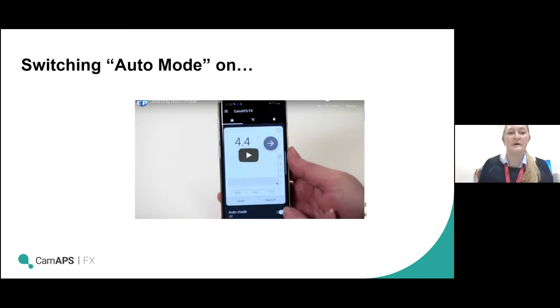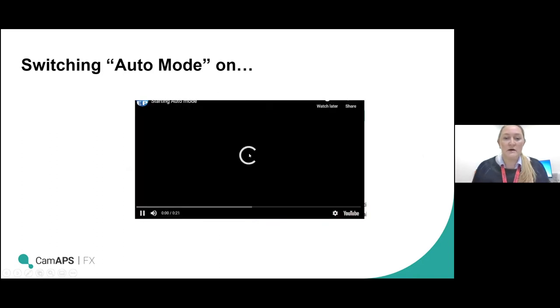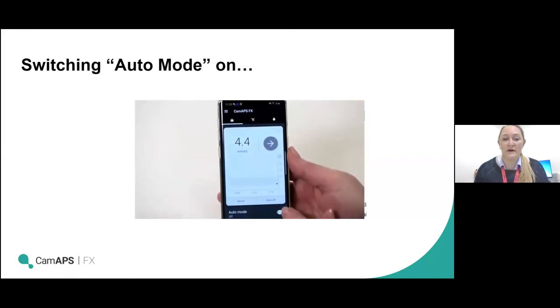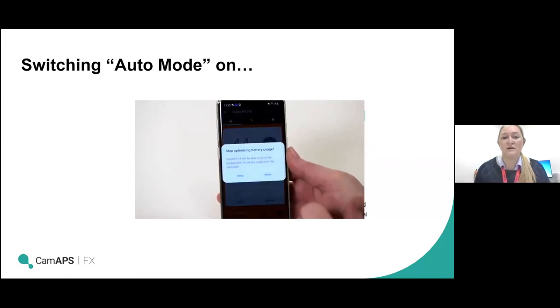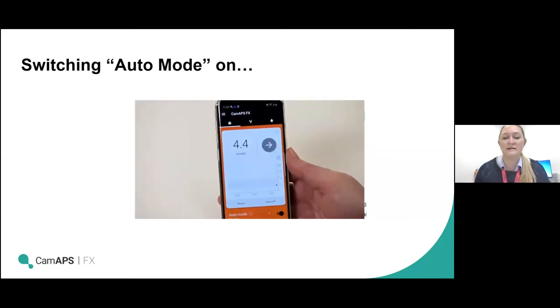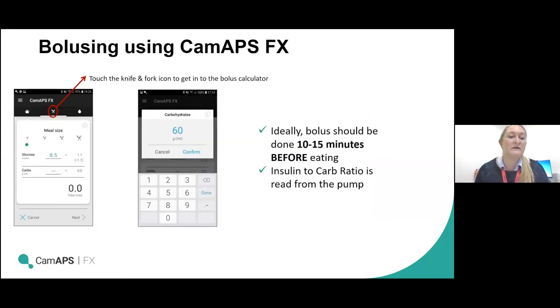What we thought we'd do is show you some videos that cover switching on auto mode, how to bolus on the phone, and how to set ease off and boost. Most of the time, auto mode will just be on and the screen will be green. But when you switch auto mode on, the system asks you to confirm, asks about optimizing battery usage — always allow — then pulls all data off the pump and the screen goes green. That's when auto mode is running, and that's when you would see the pump flashing 'no delivery.'